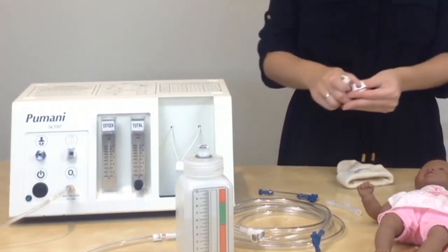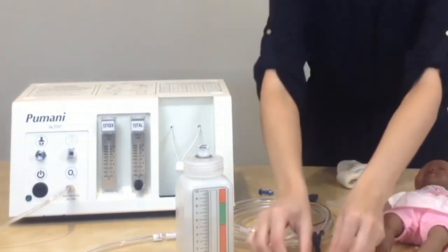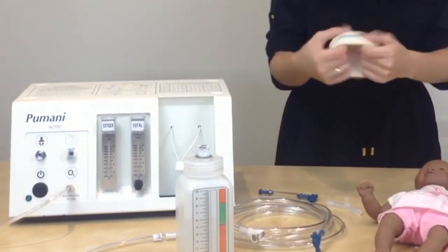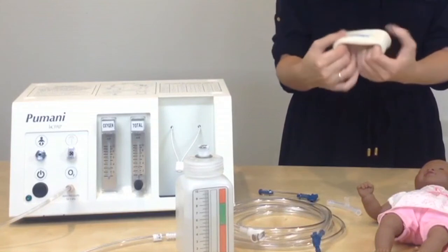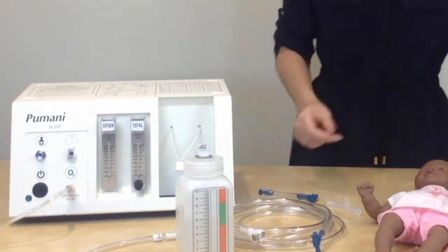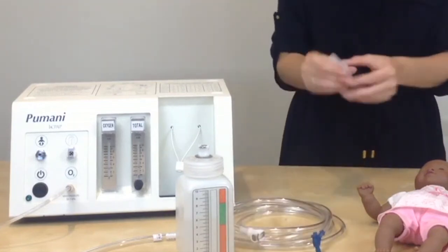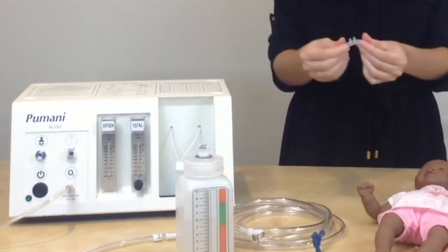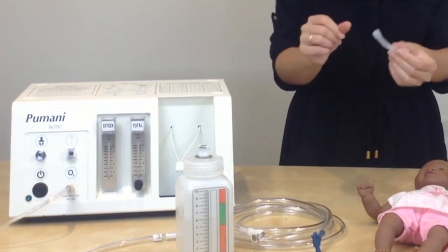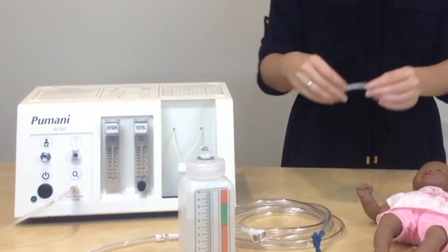The hat clips are designed to be reused, and you can clean and reuse them. The hats typically stretch out when they're on a baby, so you will need to throw out the hat and start with a new hat for each patient. The end cap can be cleaned and reused. The prongs are labeled as single use only and are typically used for only one patient; however, you may choose to clean them on your own.